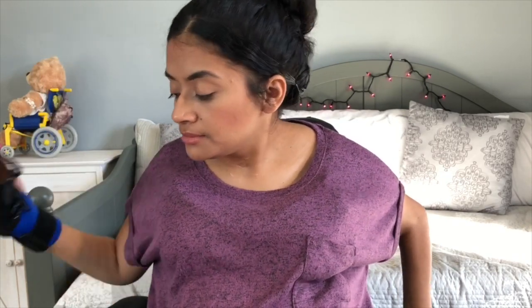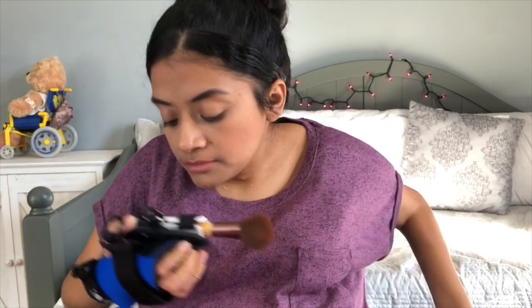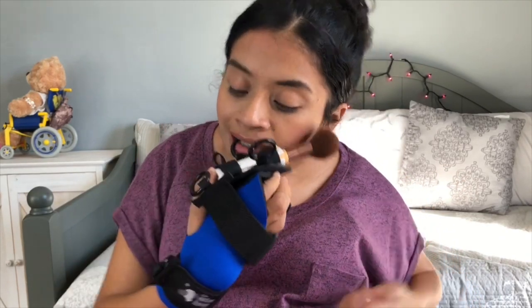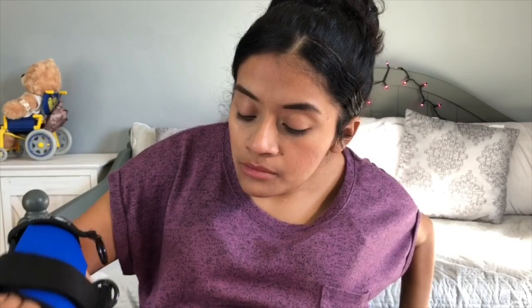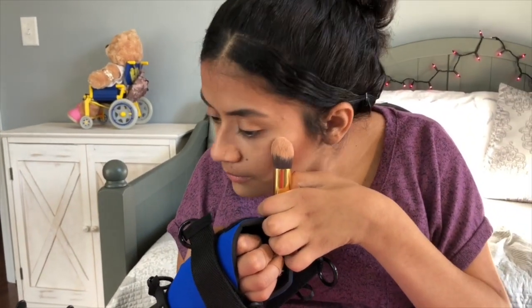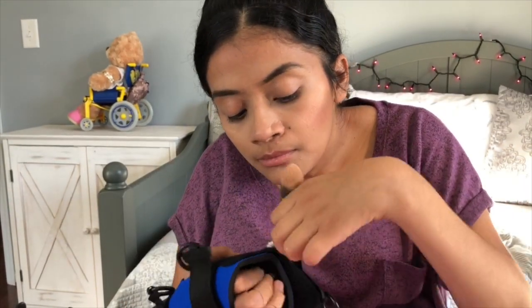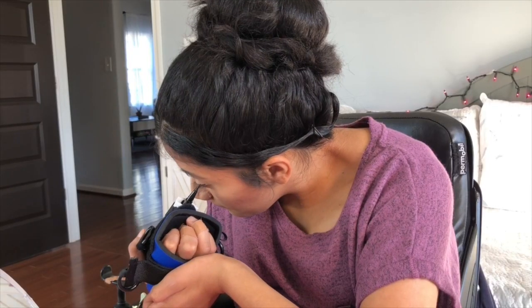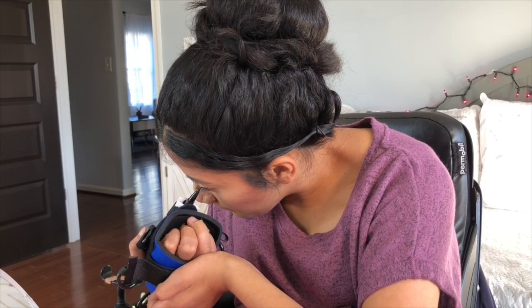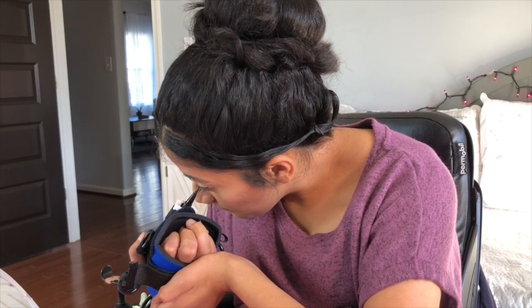So right here I have the new Active Hands gripping aid. It comes with detachable pieces that are able to hold objects of different thicknesses — no matter how thin or how wide the object may be, it's able to adjust to different lengths. As you can see right here I have the makeup brushes. This one is thinner than this one and right here is an eyeliner. As you can see it's very thin, and so we'll see how I'm able to work with these pieces in order to do my makeup.